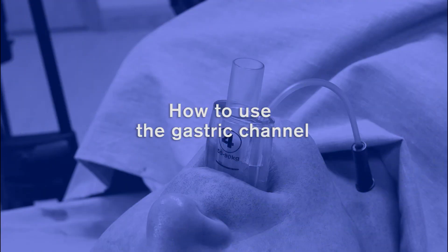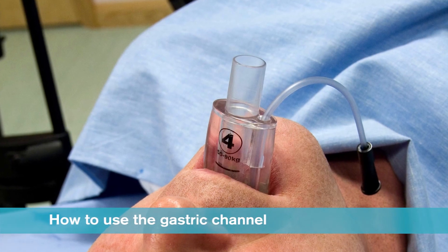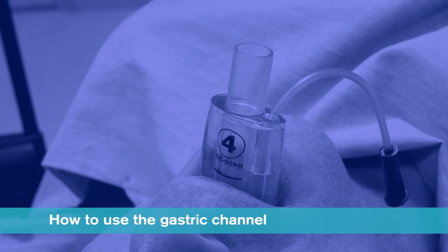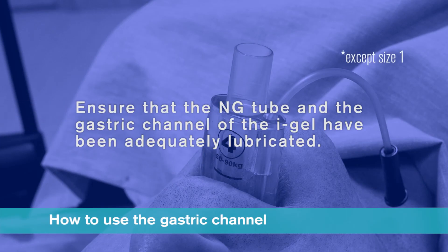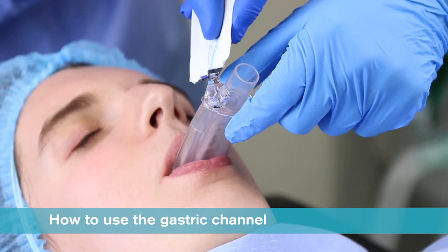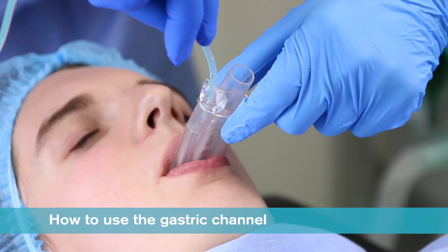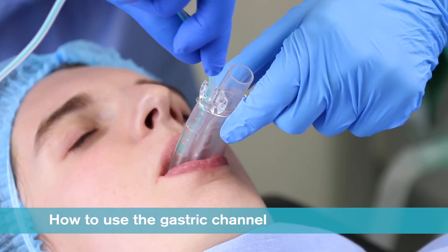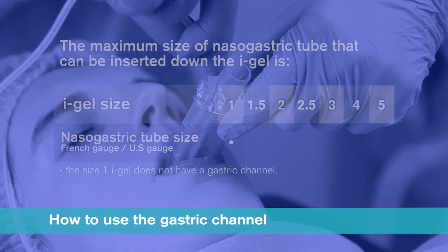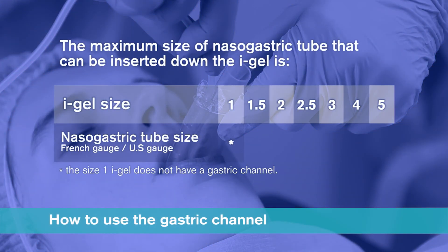How to use the gastric channel: If required, a nasogastric tube can be inserted down the gastric channel of the iGel. For a quick and efficient insertion, it is important that the nasogastric tube and the gastric channel of the iGel have been adequately lubricated before insertion is attempted. The ideal way to achieve this is to place a small bolus of lubricant over the proximal end of the gastric channel. The nasogastric tube should then be inserted a short way down the channel and moved in and out to prime it before completing insertion. The maximum size of nasogastric tube that can be inserted down the iGel is size 10 French gauge for a size 1.5, 12 French gauge for a size 2, 2.5, 3 and 4, and a size 14 French gauge for a size 5 iGel.